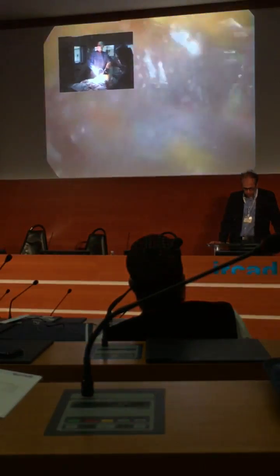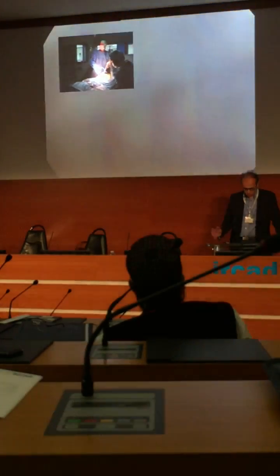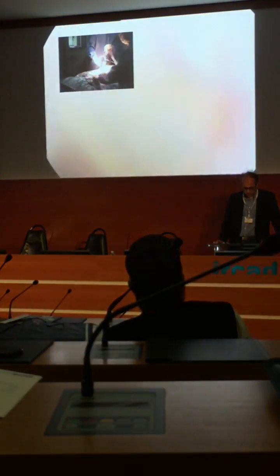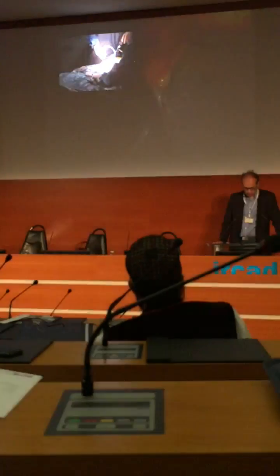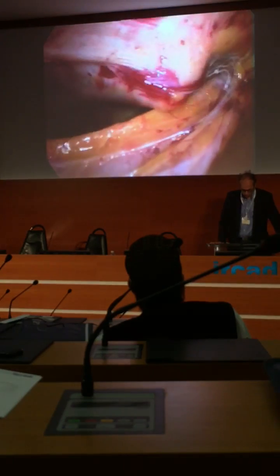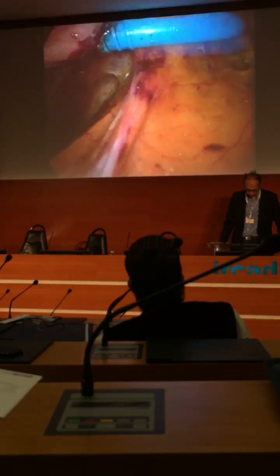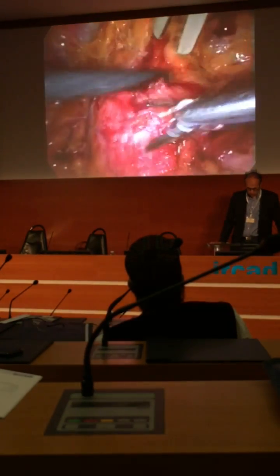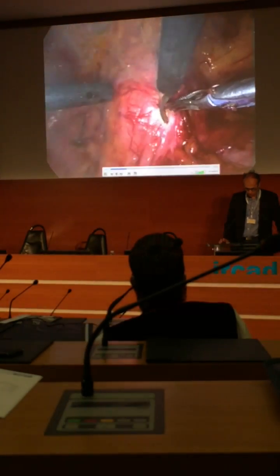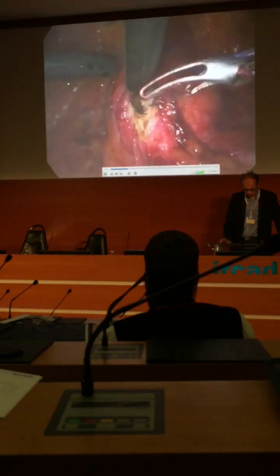And when you introduce the scope, you notice this specific aspect of arachnoid tissue. And with the movement of the lens and with the pressure of the gas, you create the space. We rapidly see the Veress needle in here. And when the lateral spaces are prepared, you can introduce the lateral trocars that you will need. So Eric Mandron is left-handed, so he used this monopolar scissor in the middle and a grasper in his right hand, and the assistant has a suction device.